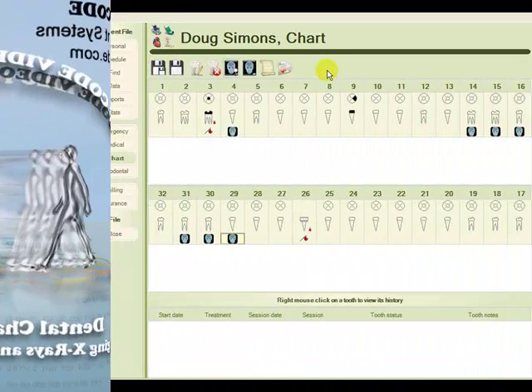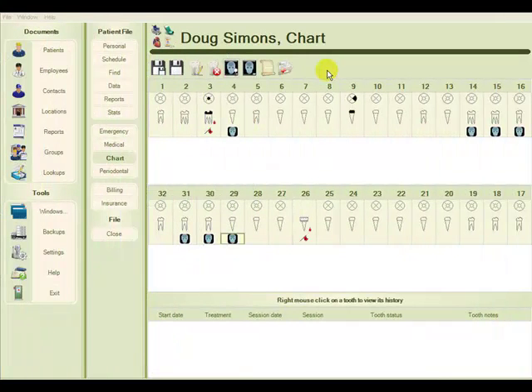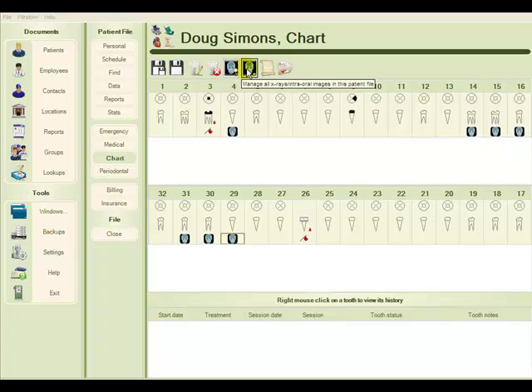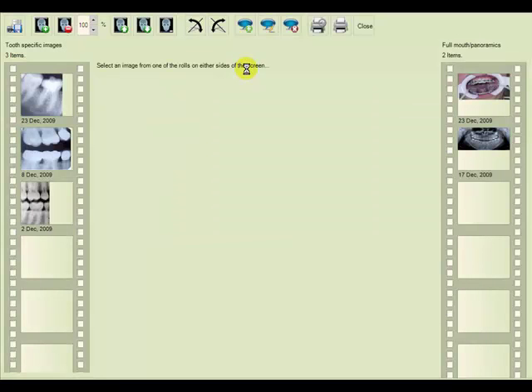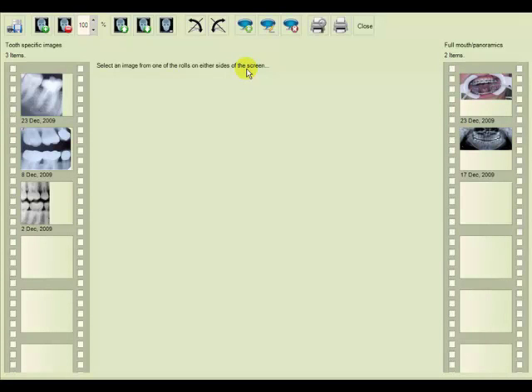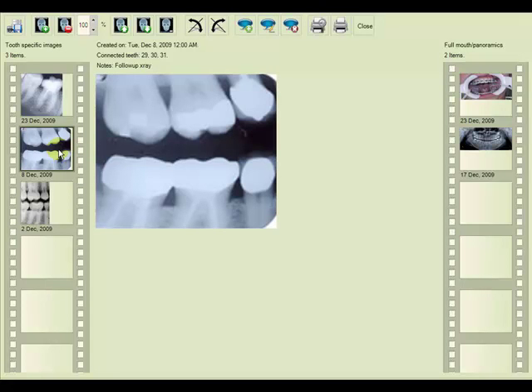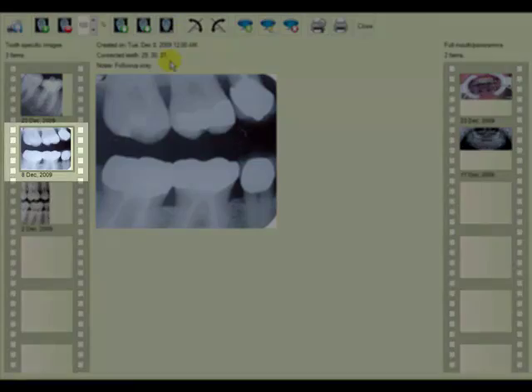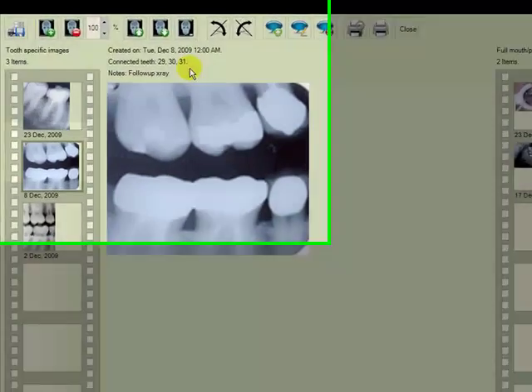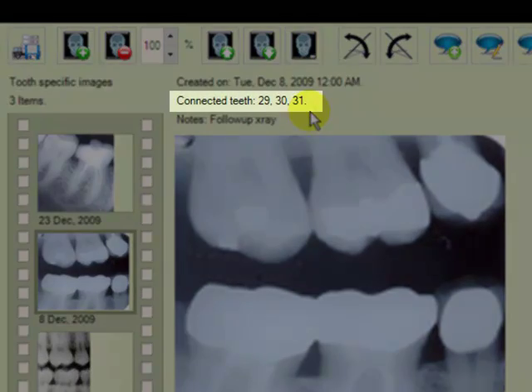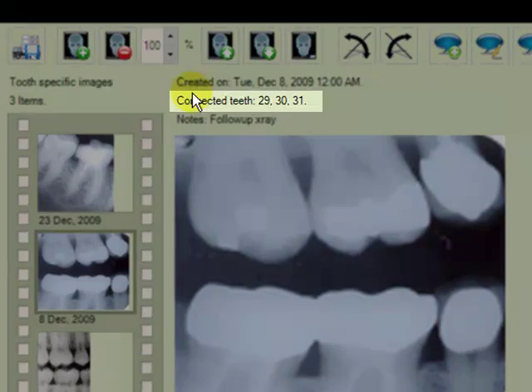There are two ways to remove old or irrelevant images. We can go to manage all X-rays and then choose the image we would like to delete, such as this one. Note that this X-ray is connected to teeth 29 to 31.